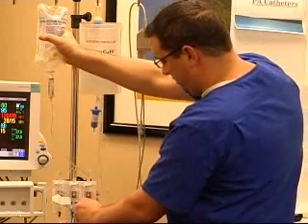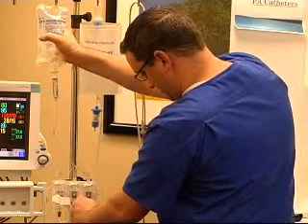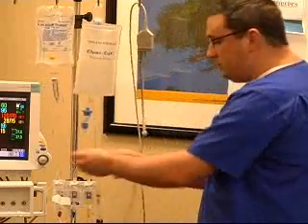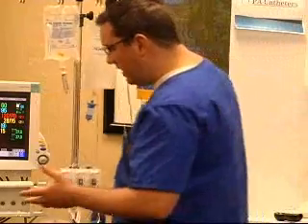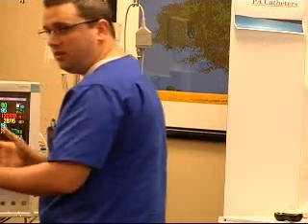Good thing it's carpet in here. Okay, so then you've got your system set up and you're ready to go. Now, as far as connecting it to the monitor, you can go ahead and do that if you want to. Sometimes that just makes the alarms go off.